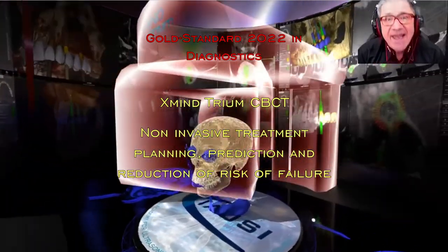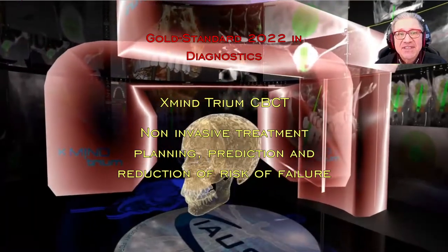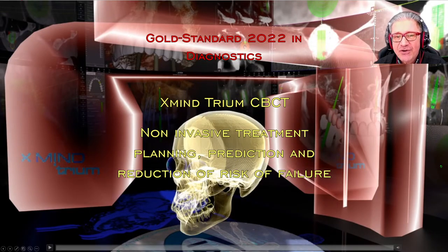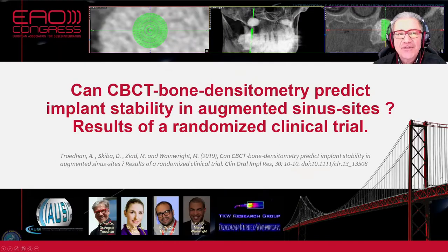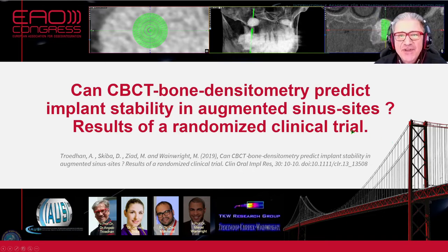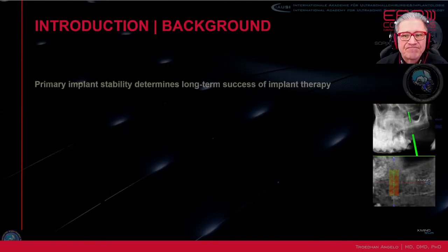Of course, you can nowadays also use CBCT diagnostics as a non-invasive treatment planning and the prediction of reduction of risk of failure. So how does this work? We presented a randomized clinical trial at the Madrid conference of the European Association of Osseointegration, asking the question, can CBCT bone densitometry predict implant stability in augmented sites, which was, as I told you before, a randomized clinical trial.